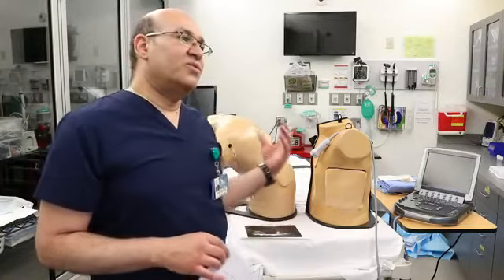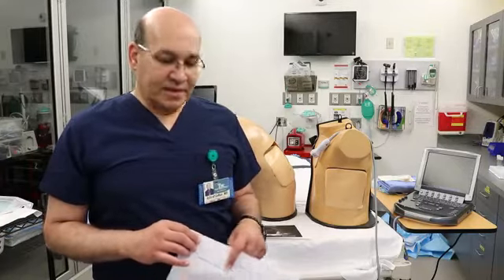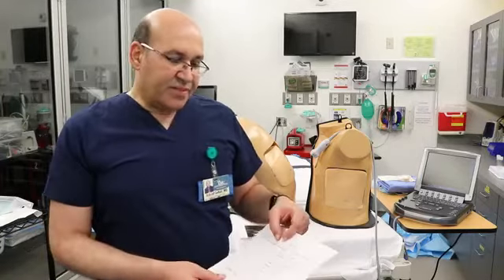Also need to check with the patient if he has any side effects. So we are using lidocaine here for this procedure. If he had any side effects of lidocaine before, you need to know that, and in this condition, you shouldn't use it. Okay, so after that, the position.